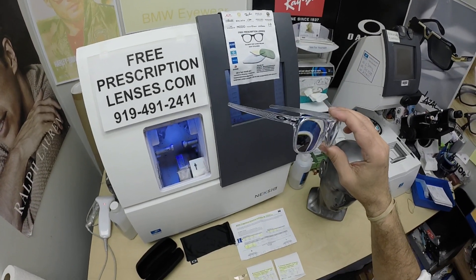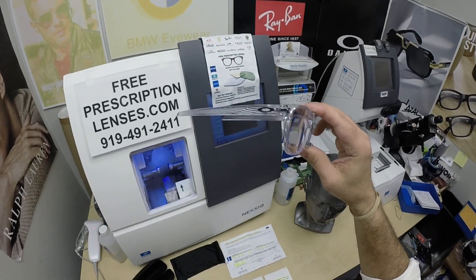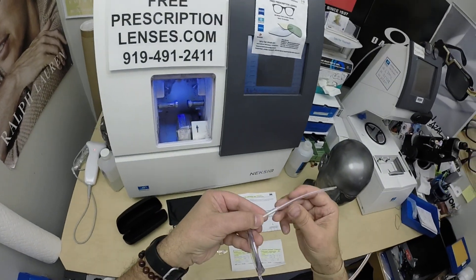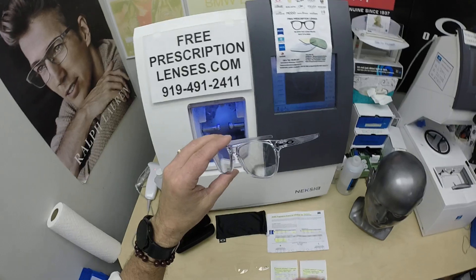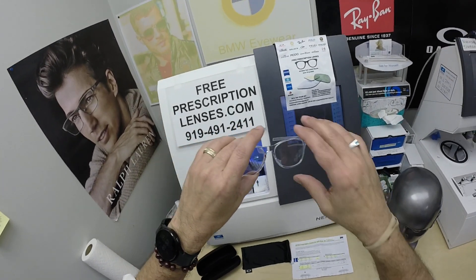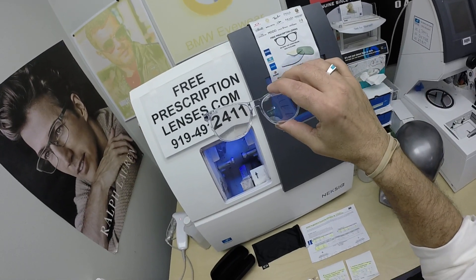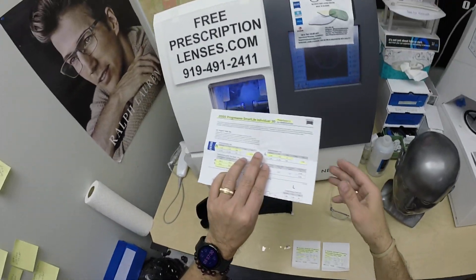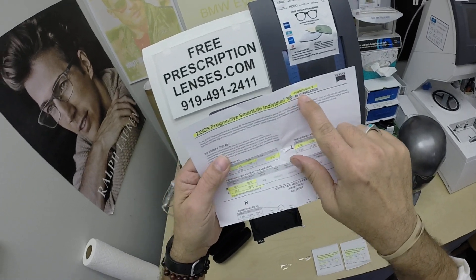It comes in five colors: black with a silver emblem, black with red on the front, a polished clear — color code 03 — a Havana tortoise color, and a smoke gray. It sells for $184 complete with one free pair of clear single vision prescription lenses. However, Brett got the premium progressive lens from Zeiss — the Smart Life Individual 3.